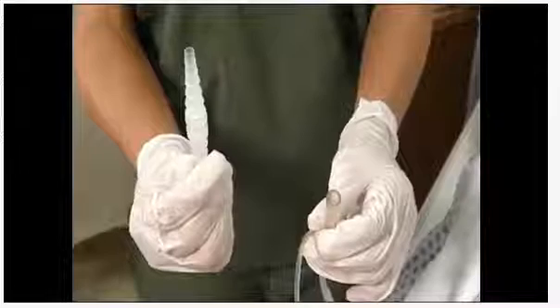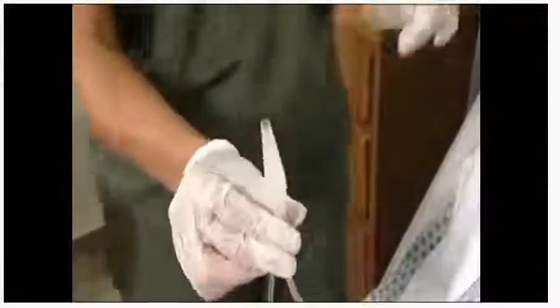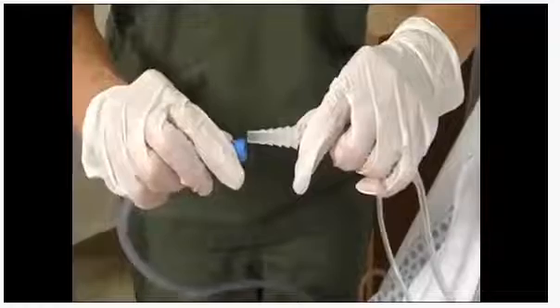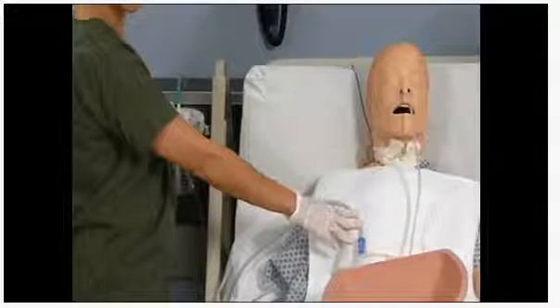You're going to need your connector. And again, don't attach it to the pigtail, attach it to the other part. At this time, I want to go ahead and make sure that it's turned on, low intermittent wall suction, or whatever the doctor's orders have stated.